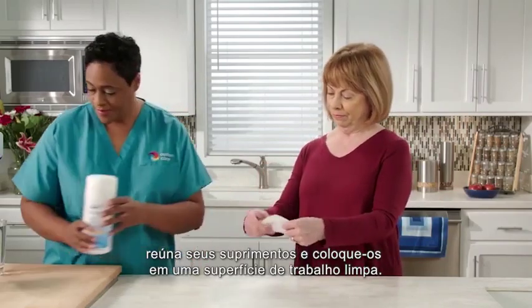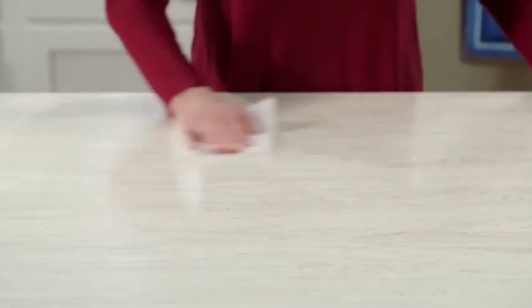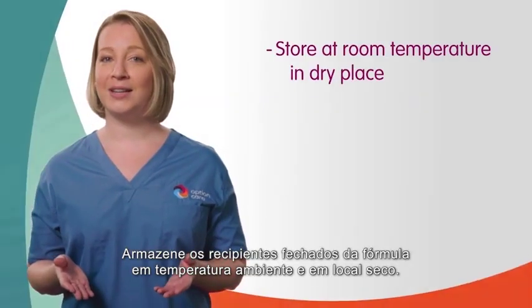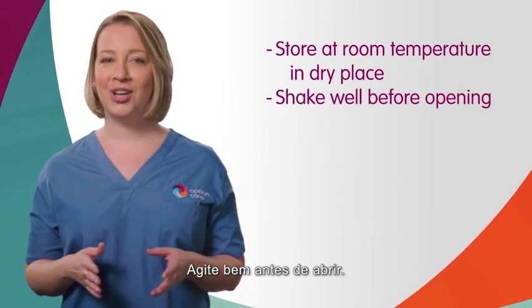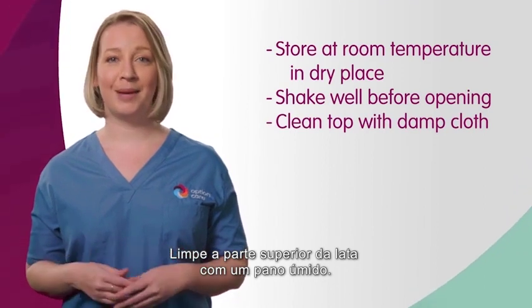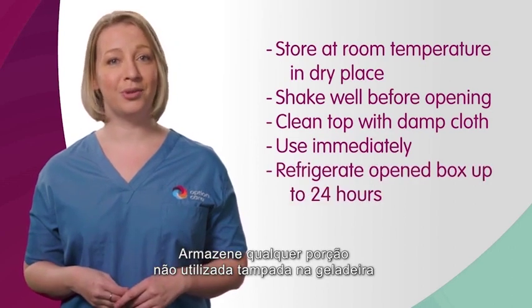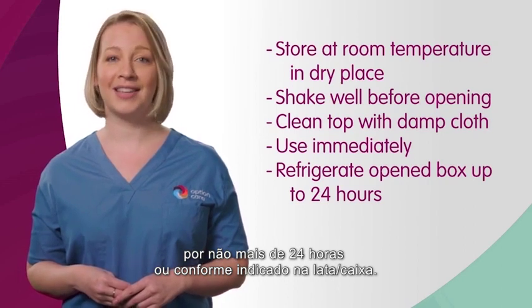First, gather your supplies and place them on a clean work surface. For your tube feeding, you will need cans or cartons of formula. Store unopened containers of formula at room temperature and in a dry location. Shake the can well before opening. Clean the top of the can with a damp cloth. Once a can is opened, use immediately. Store any unused portion covered in the refrigerator for no more than 24 hours or as directed on the can or carton.